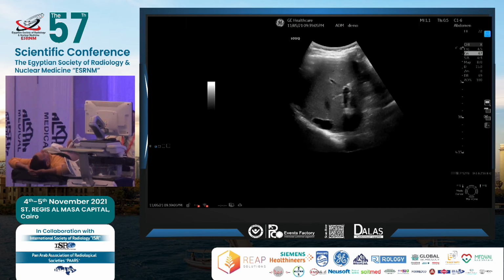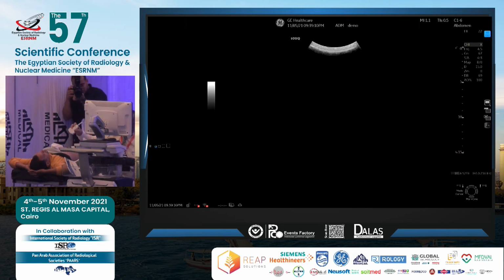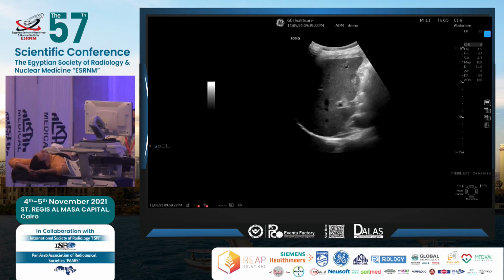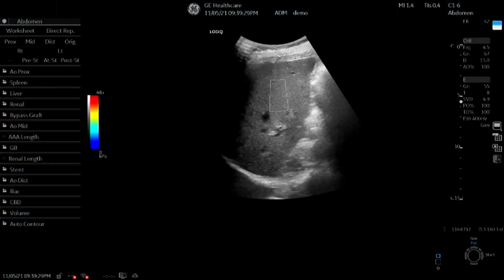Of course, the 2D image on the screens is not like the ultrasound, so later whoever wants to see further, we can show on the ultrasound system. So this is the typical view that we usually get for the liver, but I can see lots of vessels and lots of things that can impact my exam. What I do in such a situation, I just go one rib down, I pick elasto, and I ask my patient, stop, breathe as much as you can.